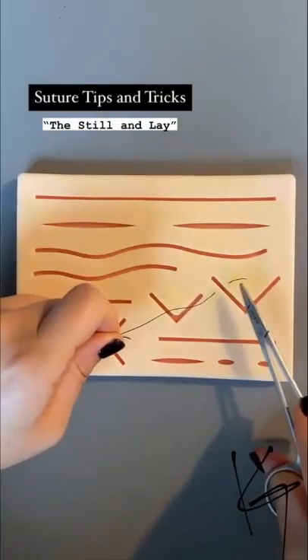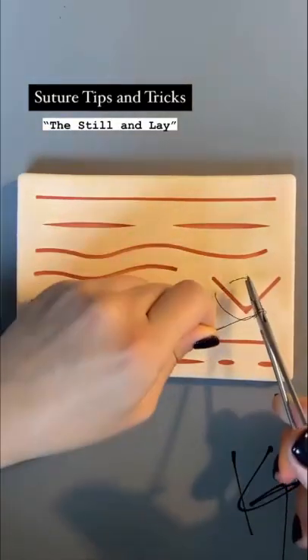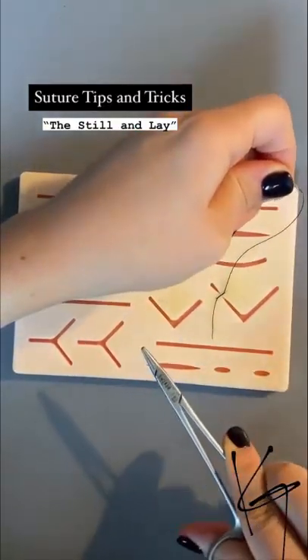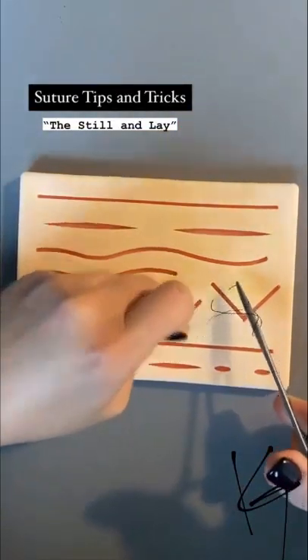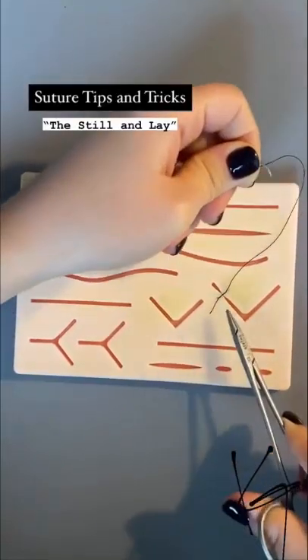How to preserve the length of your suture: if you start off with a shorter tail and end up with something longer, it's because you're using the right hand and pulling the suture as you're laying it down flat. The tip is: once you have the appropriate length, keep the right hand as still as possible and lay it flat — that way you preserve the length of the suture tail.